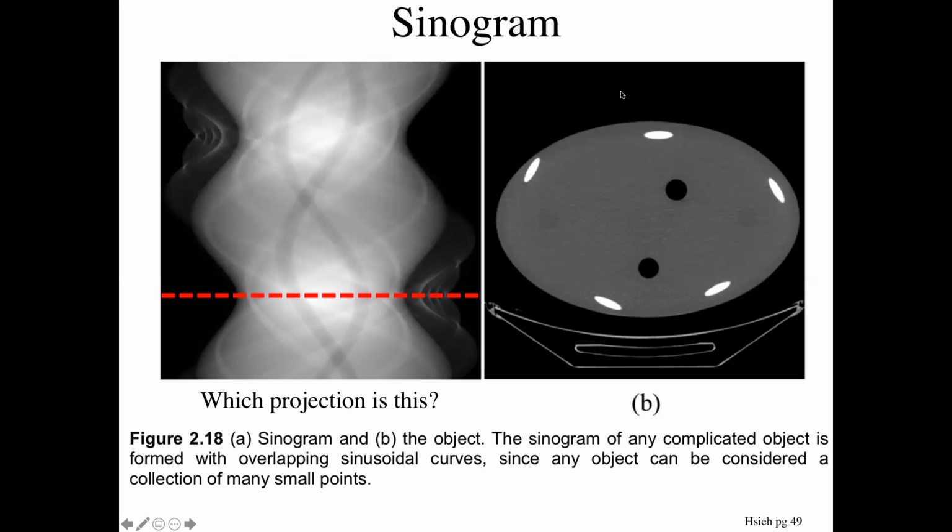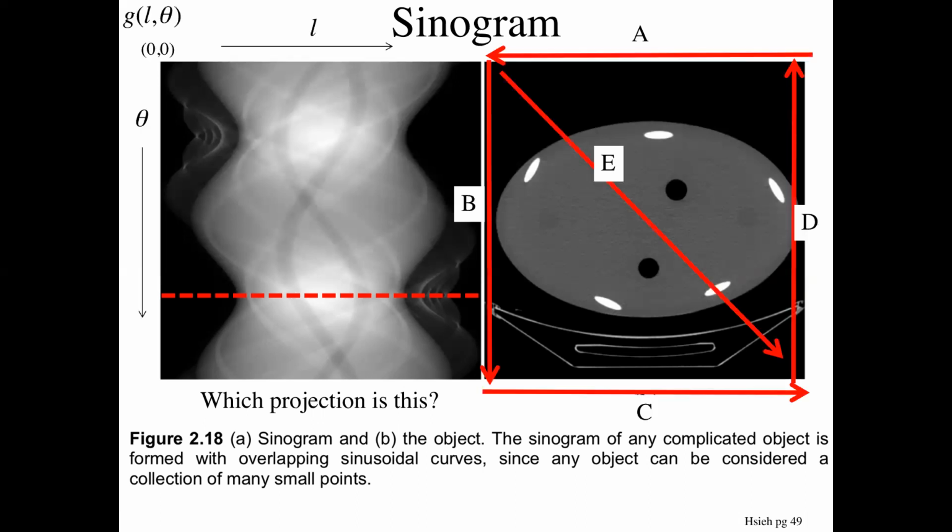So it's either the x-rays are coming this way and hitting our detector over here, or they're coming this way and hitting our detector over here, right? And so the question is, which one of these, A, B, C, D, or E, is that function?